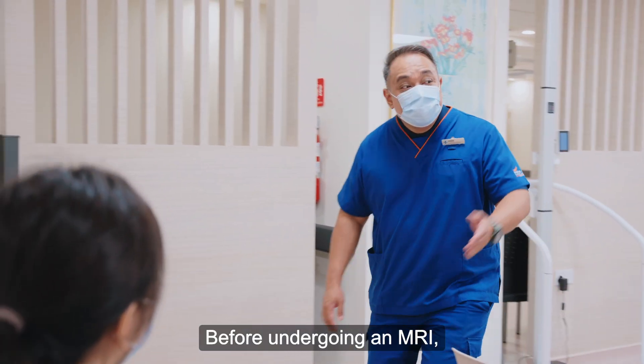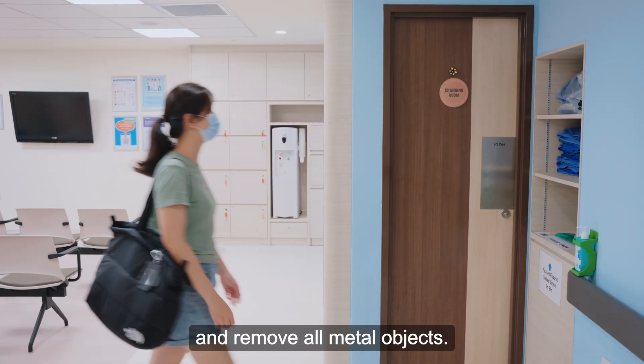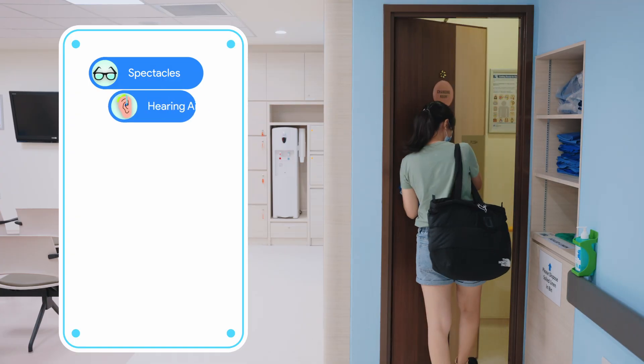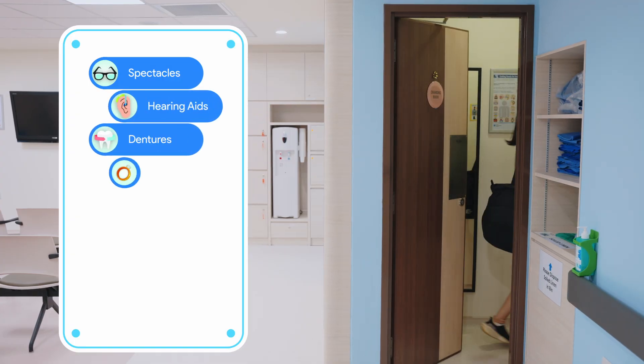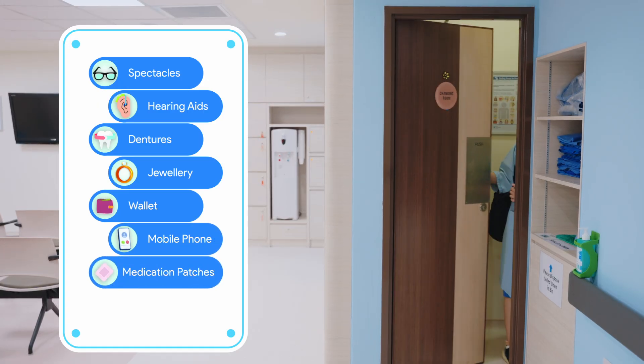Before undergoing an MRI, you will be asked to change into a hospital gown and remove all metal objects. These include spectacles, hearing aids, dentures, jewelry, wallet, mobile phone, or medication patches.